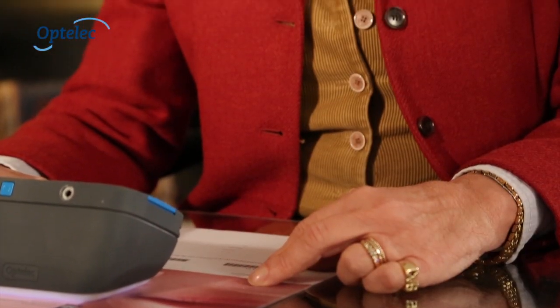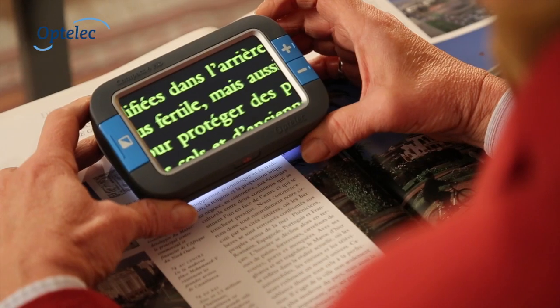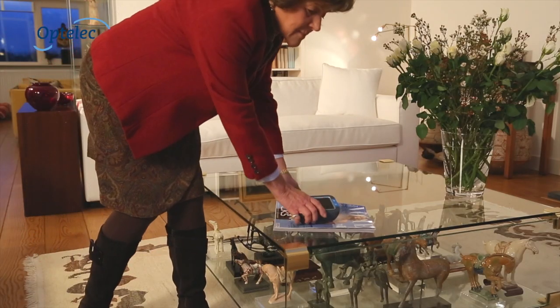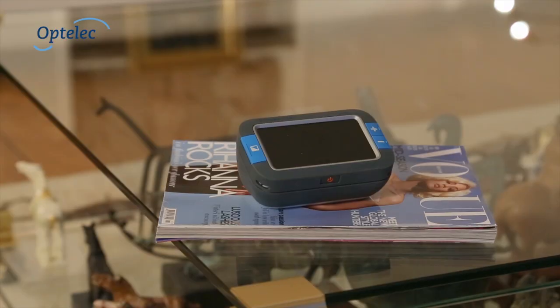The Compact 4HD's special shape resembling that of a dome magnifier with a soft touch finish makes the product comfortable to grip and allows it to easily slide over letters, magazines, or photos. The unique design makes the Compact 4HD a stylish product which fits right in with your decor.